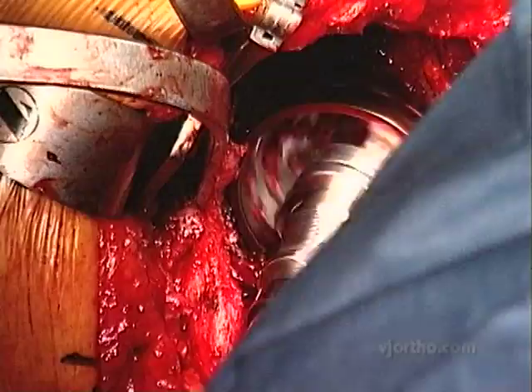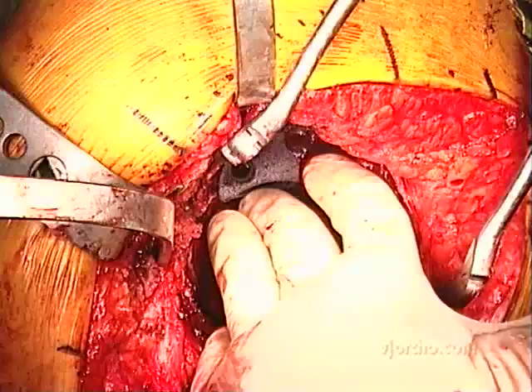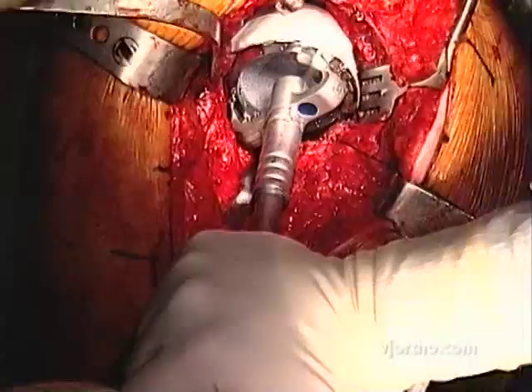Since that manuscript was written, we have made several changes. We have gotten away from using the distal femoral allografts for most patients except the very young, and are now using trabecular metal acetabular components with a trabecular metal augment — effectively using metal where we used allograft bone in the past. The trabecular metal augment, shaped like a distal graft, will ingrow into the ilium just as the distal femoral allograft would. It provides buttress support, held with three 6.5 cancellous screws, and will provide initial support until ingrowth occurs in the cup.